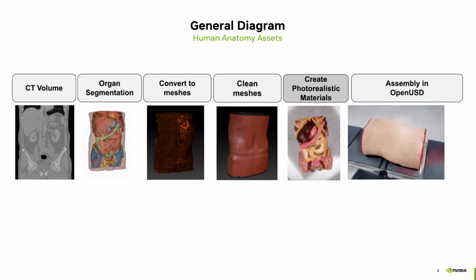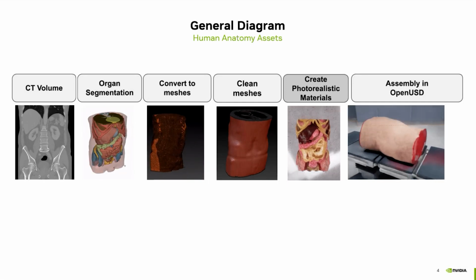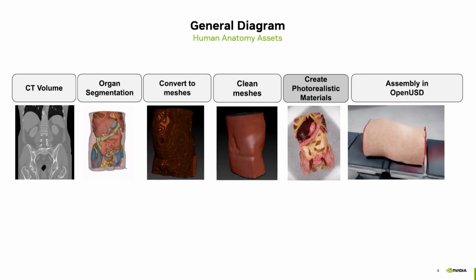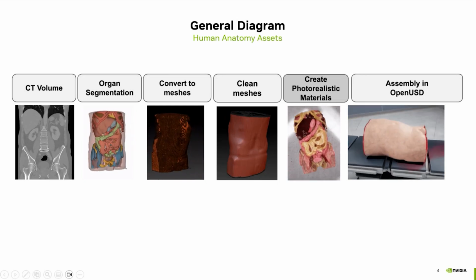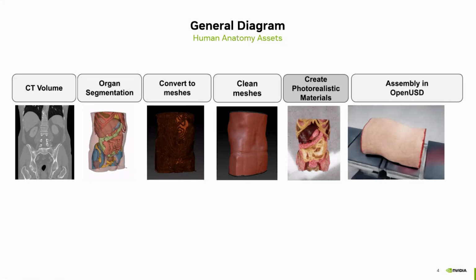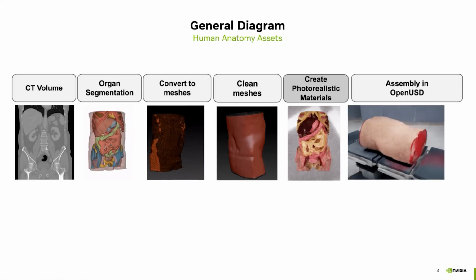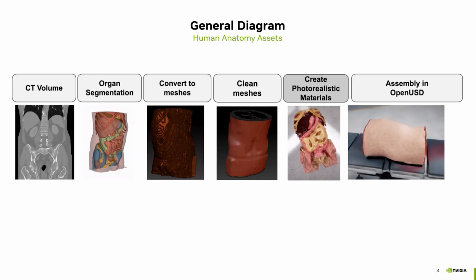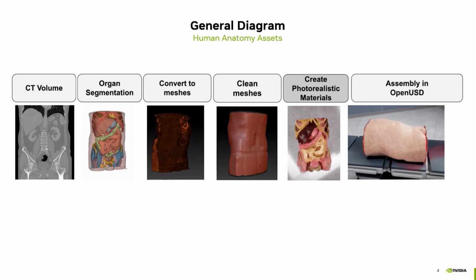The third step is converting the organ masks into OBJ files. This is basically because it's the standard 3D file format for visualization, or for any software that uses surface meshes.